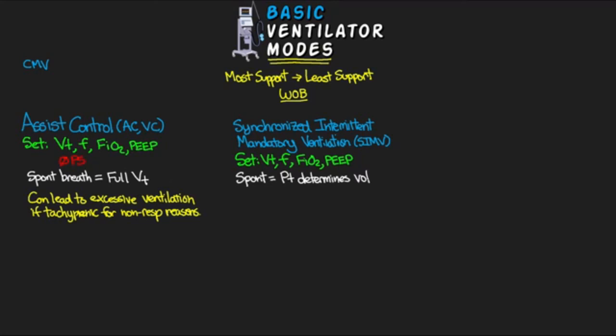And so now the breaths that we're delivering through the vent are actually going to be synchronized with the patient's own spontaneous breaths to really help to increase their vent compliance. So essentially, as long as they take a breath in a predefined window between each of the two mandatory breaths, then if they go to initiate that breath, whatever breath they take, the size, the volume that they get is what they get.